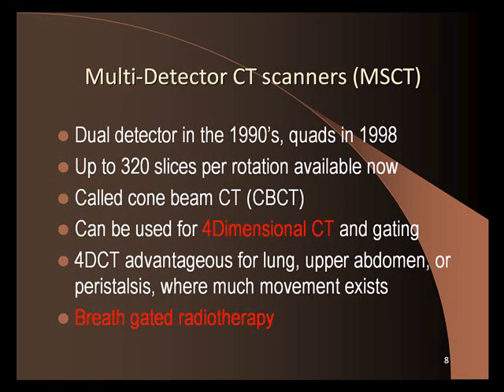So now it's looking. The older scanners were like a fan beam. It was a flat beam of X-rays. Now they're wider, and they're calling that a cone beam because it's like a cone of radiation. And all these detectors are picking up the signal, the X-ray attenuation.